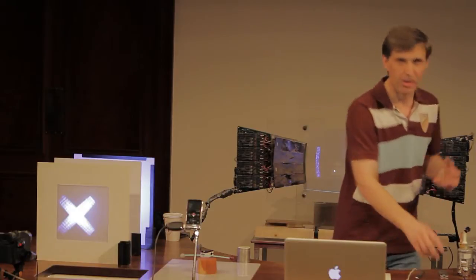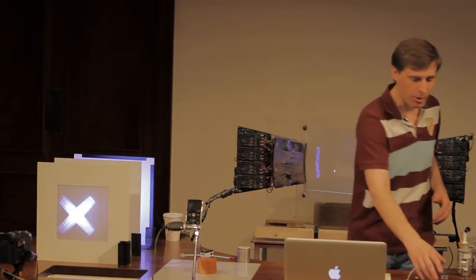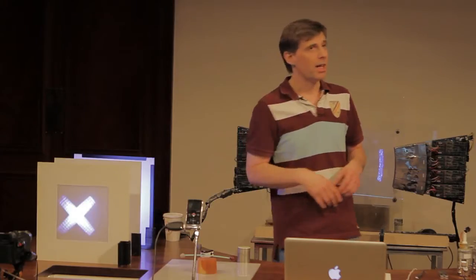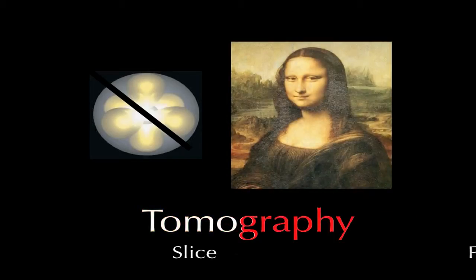The first word is just the funny name that we use for slicing the body up like this. It's called tomography. It's got 2 parts to it. The first one, tomo, is a Greek word which means slice, tomos, slice. And you probably know the word atom. Atom means can't slice, the thing that you can't carve up. So tomo means slice, and graphy is another Greek word which means to sketch or to doodle, or in this case, to make a picture. So tomography is a word that you'll hear a lot in medical imaging, and it just means slicing the body up, taking pictures of slices.